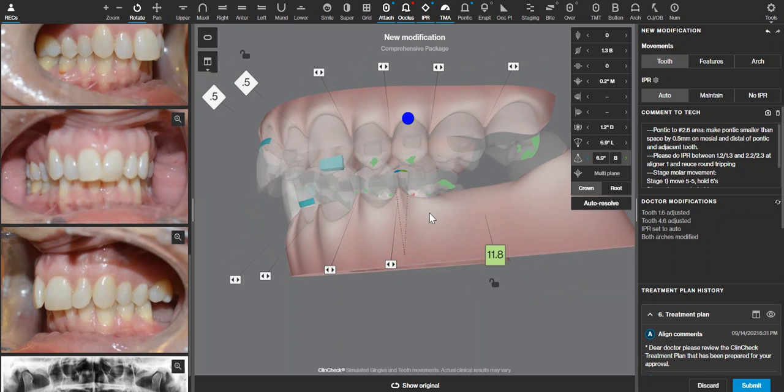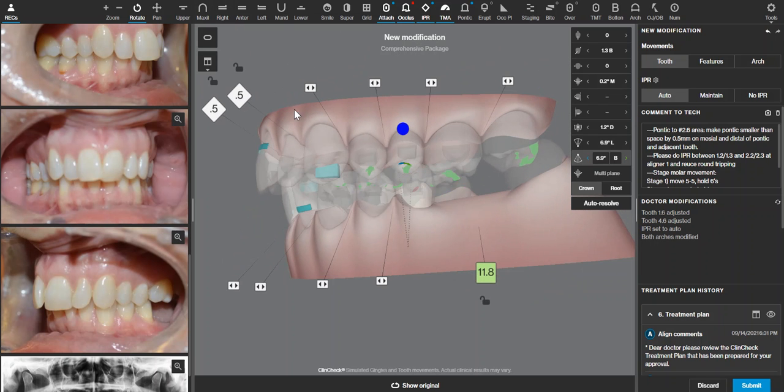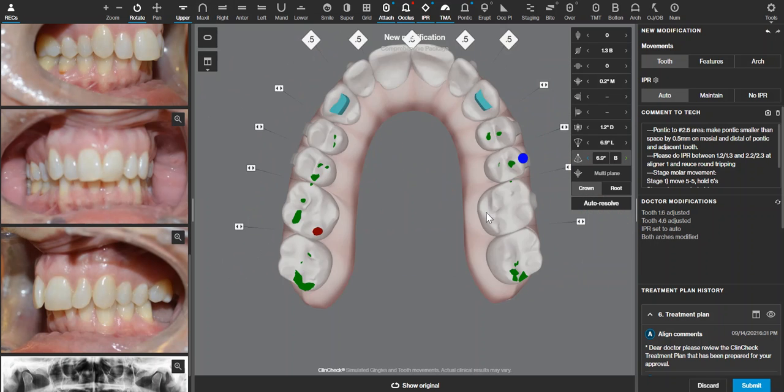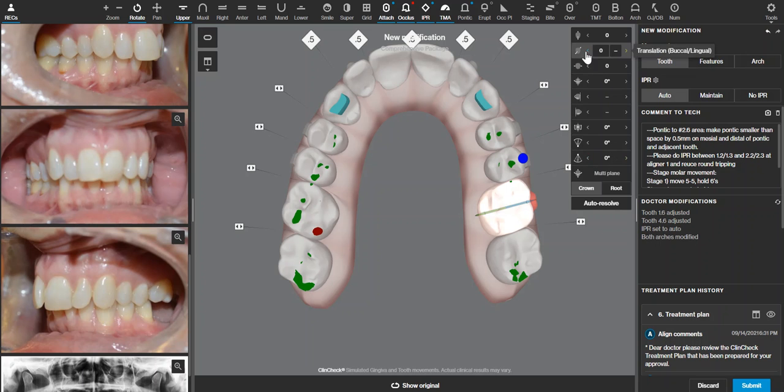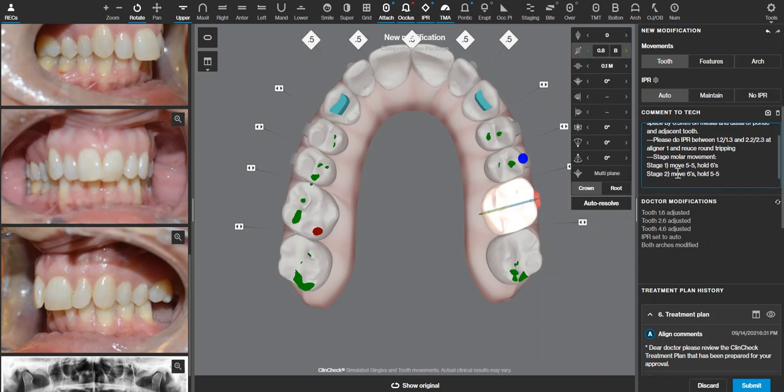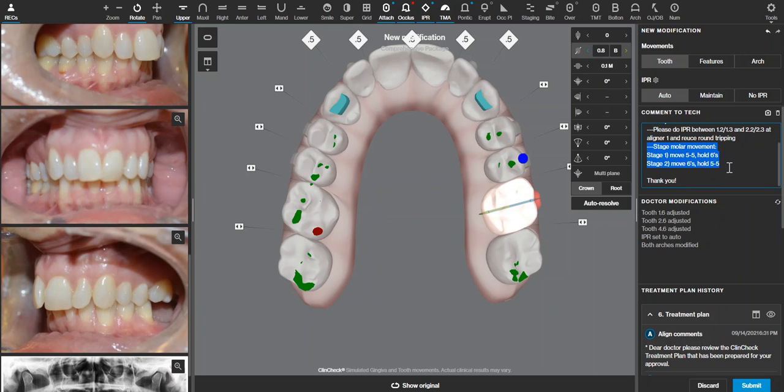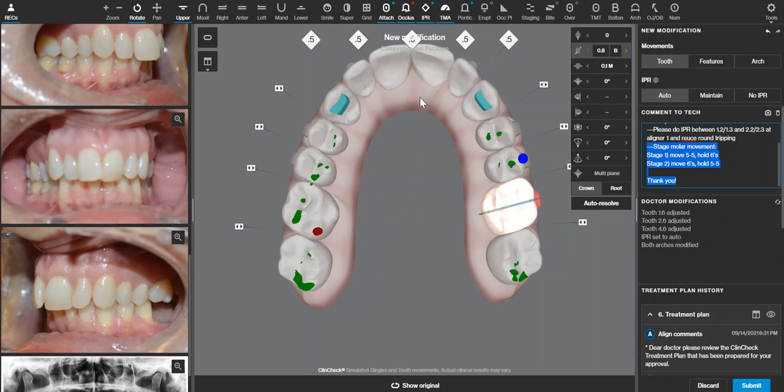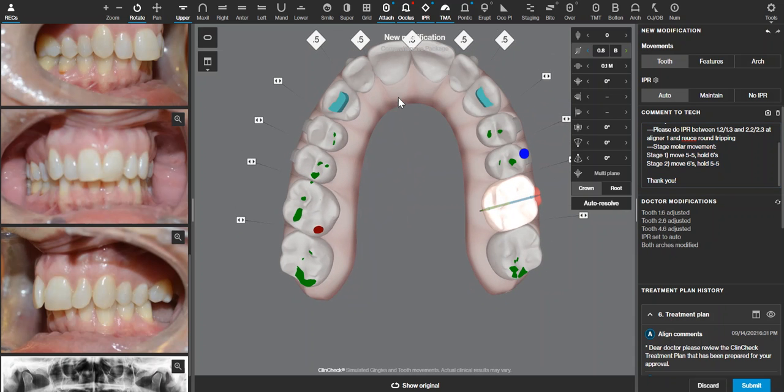We have an advantage on the left side molar that there is not an opposing, so then I can just control the expansion to whatever looks to fit within the arch. We submit from there and then I will also make sure that I have commented to stage the movements so that these molar movements are more predictable, and we'll go through those aligners at a fairly quick pace. I hope that helps.